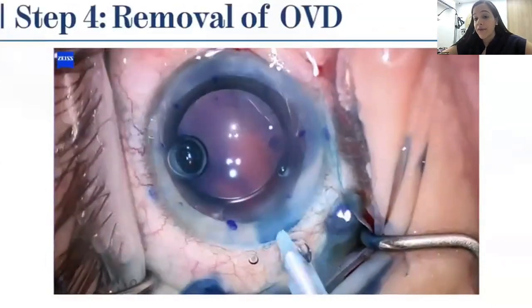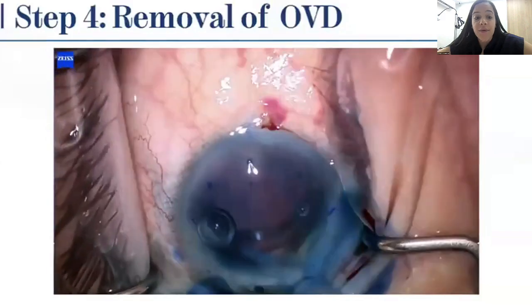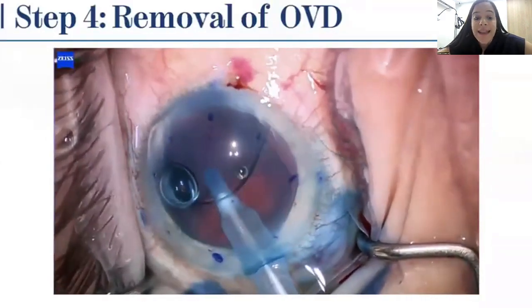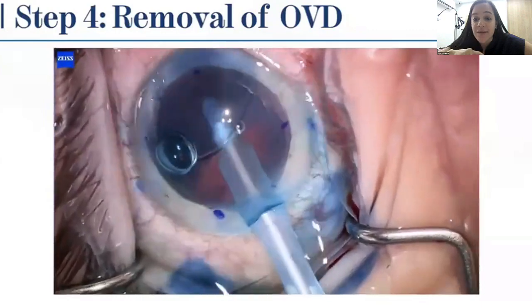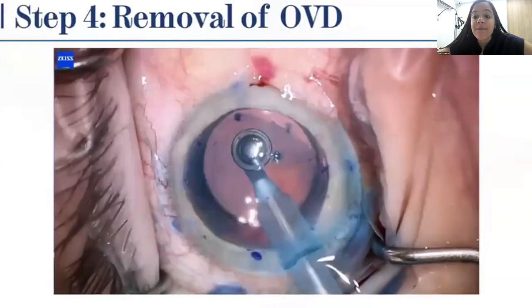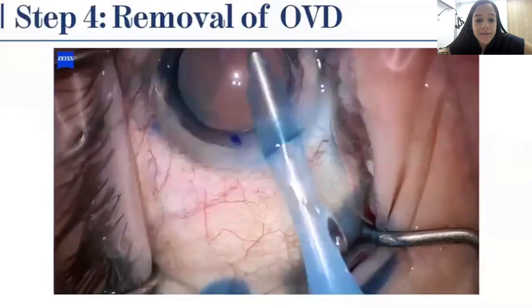Step 4, now we'll remove the OVD. We use IA to thoroughly remove the cohesive viscoelastic. We go behind the IOL and into the angle to remove any trapped viscoelastic. This is important because any retained viscoelastic may block the graft from adhesion.